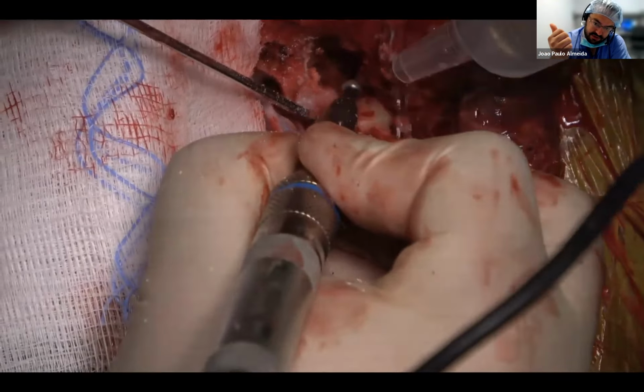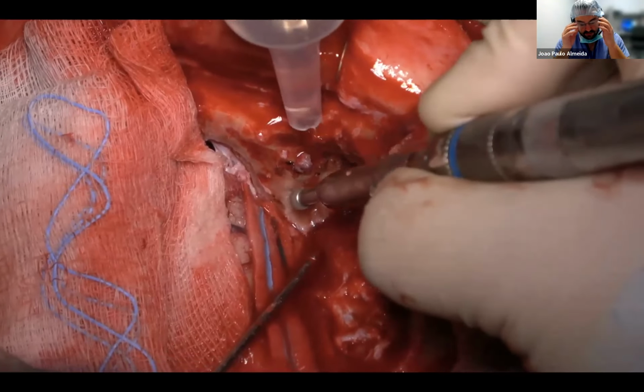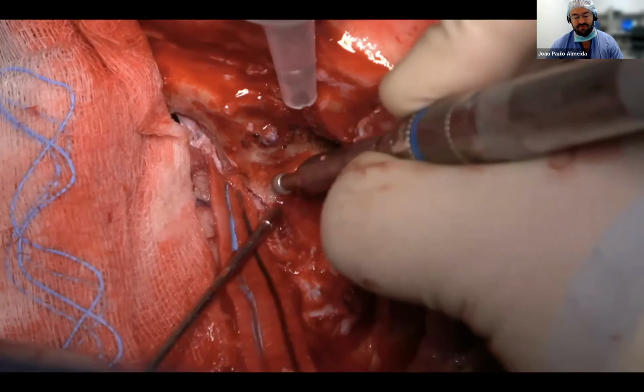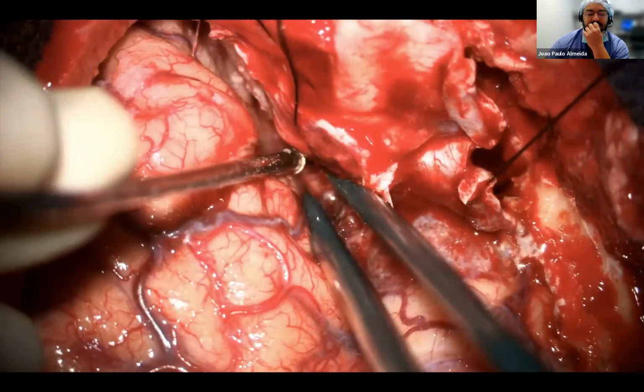Once again, sphenoid wing meningioma is a primary possibility. So we've got to drill that sphenoid wing to devascularize that tumor. And a lot of this work is done in an extradural fashion as a first step. So once that's completed, you see the frontal and the temporal lobe.